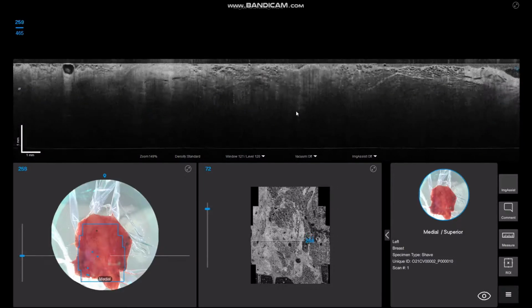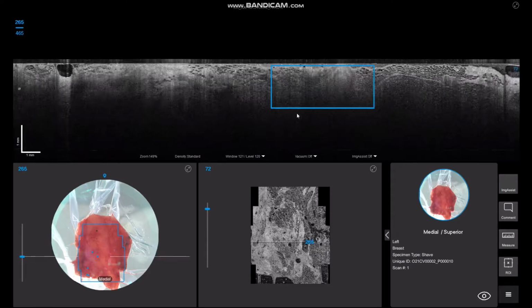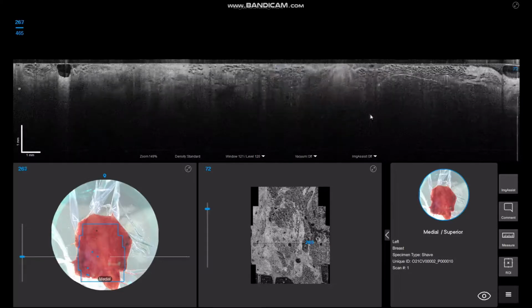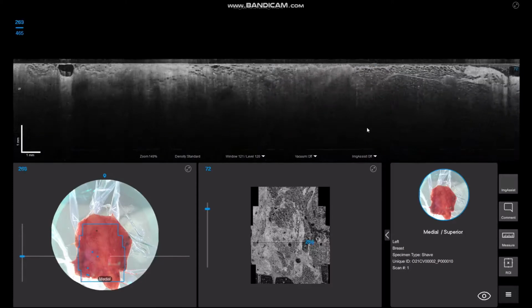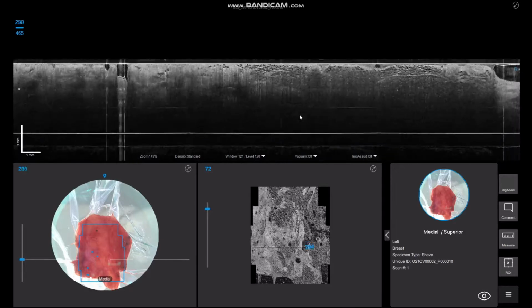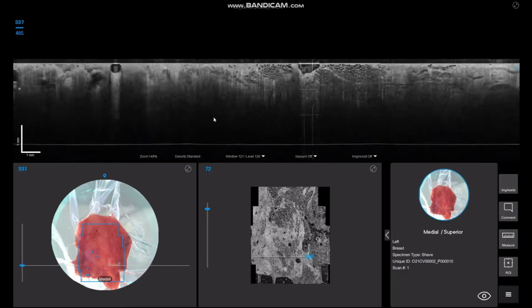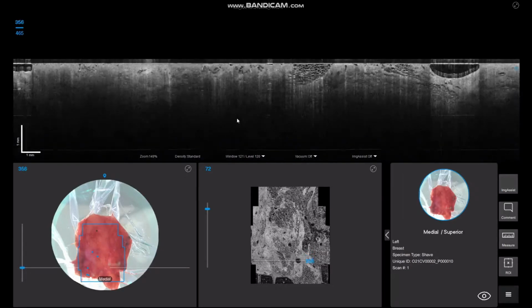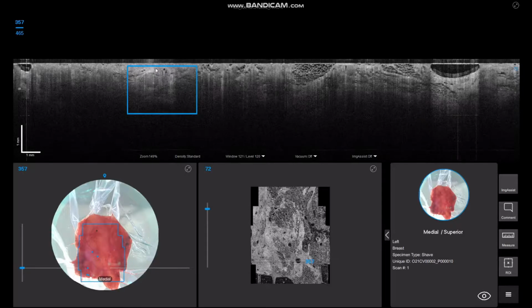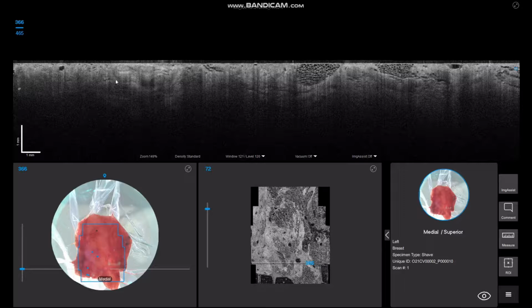And I really don't believe that this is a hindrance to what I do in the operating room, since I can have my assistant closing an incision while I am reviewing the images. So the blue boxes that you're seeing are when I find areas of concern, and I'll get into some of the images later. I'm able to go back and re-review those images. Based on my specimen, I believe this was the medial superior margin, so I can go back and re-excise those areas of concern. That's a calcification there. And I can then rescan the re-excised margin.